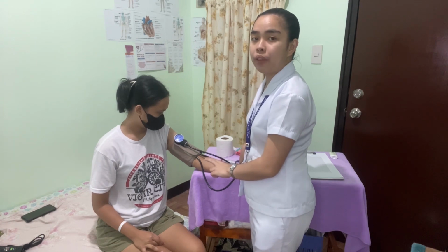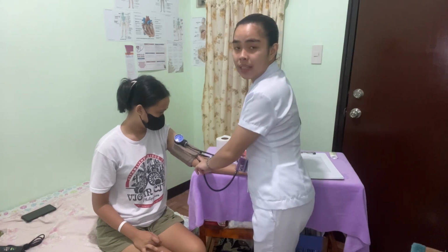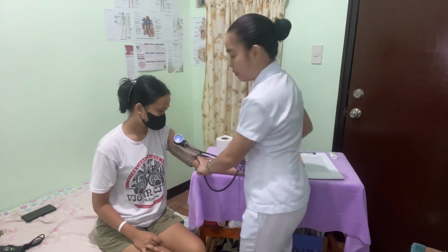Okay, and palpate for her brachial artery through the use of my 2 fingers. Once I have found the brachial artery, I'm gonna start inflating the cuff until I no longer feel the pulse of her brachial artery, and I'm gonna deflate the cuff.